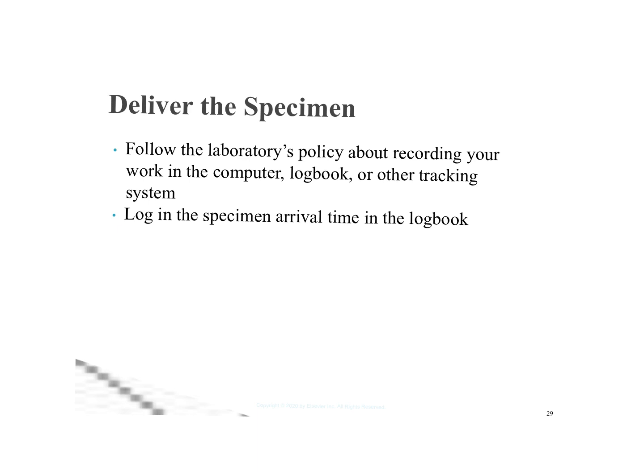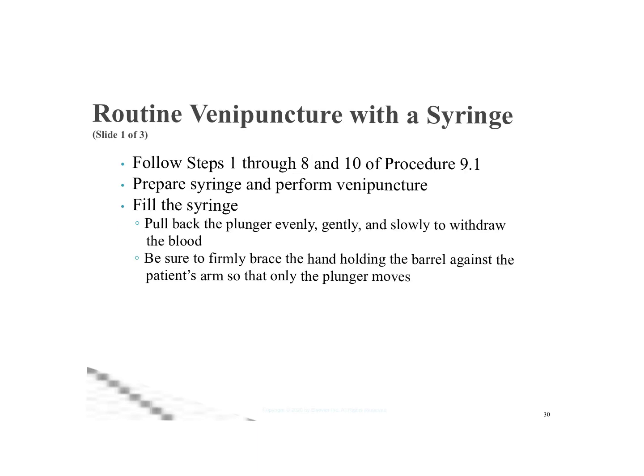Delivering the specimen, we're going to follow the laboratory's policy about recording your work in the computer, logbook, or other tracking system. Log the specimen arrival time in that logbook. And again, this is going to depend on the facility that you work for.